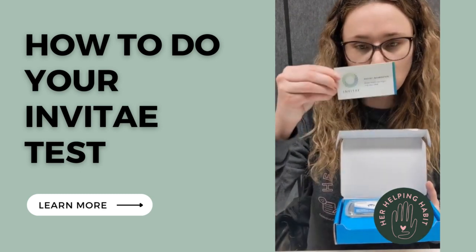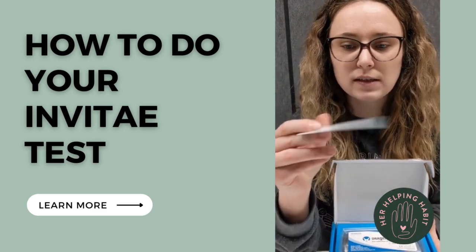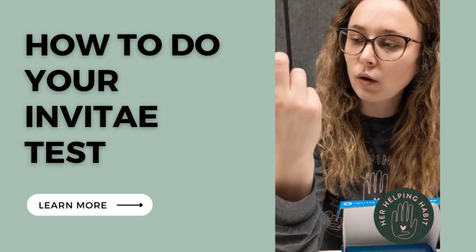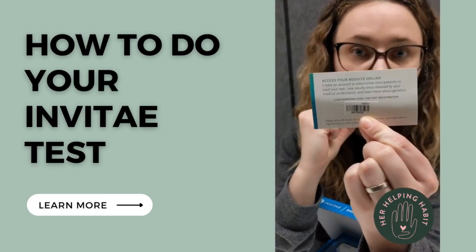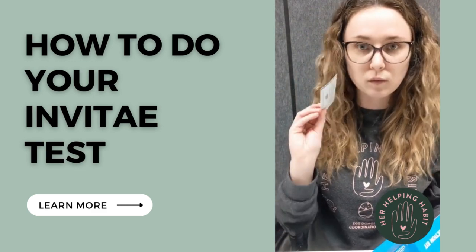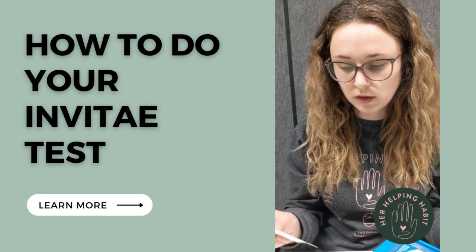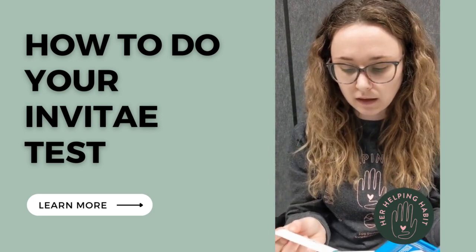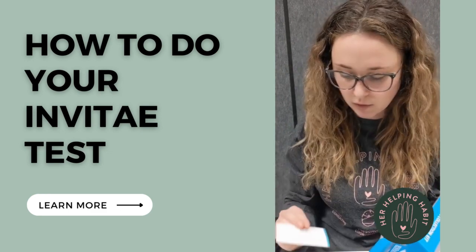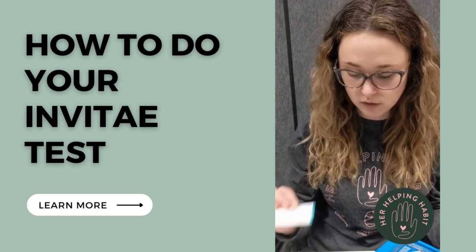This next little card is what you're going to need to send us to activate your kit. It looks like a little business card, but on the back you have an IB number at the very bottom of the serial code. This is the number you'll need to text your egg donor coordinator so we can register your test. If we've sent you an email and you have access to your Invitae account, you would just log in to your portal and enter this IB number. Depending on how we've ordered this test, you'll either give us the number or access your portal to do it yourself.